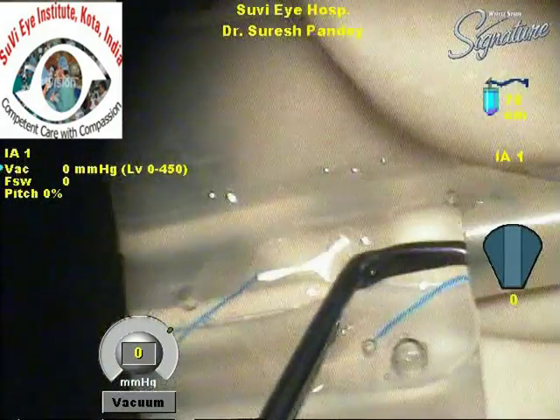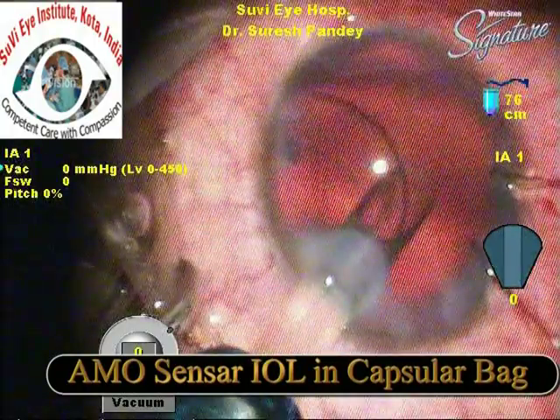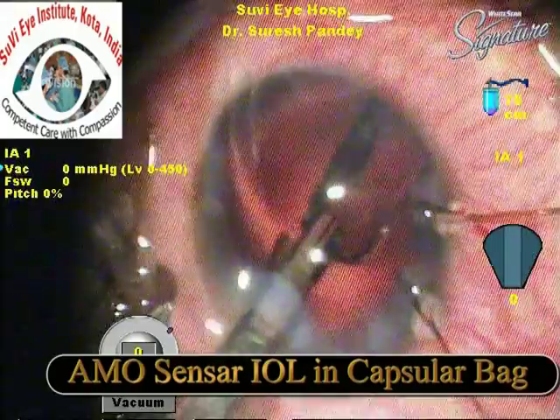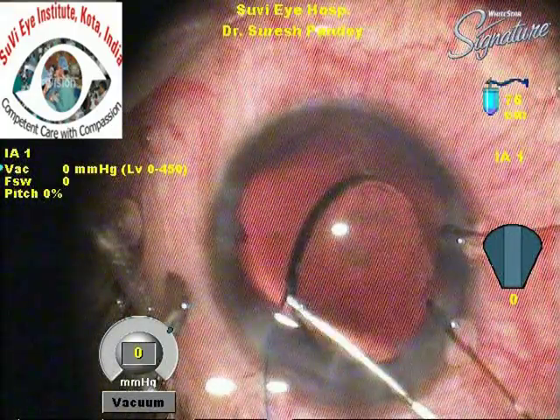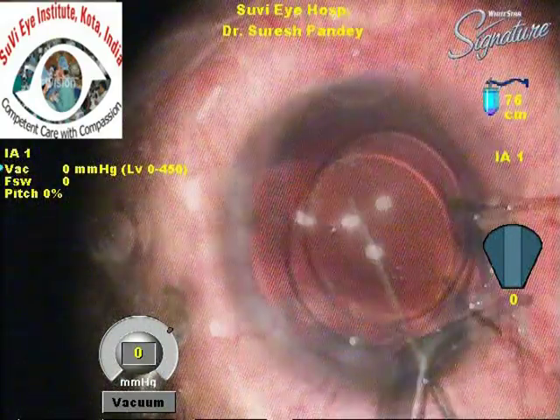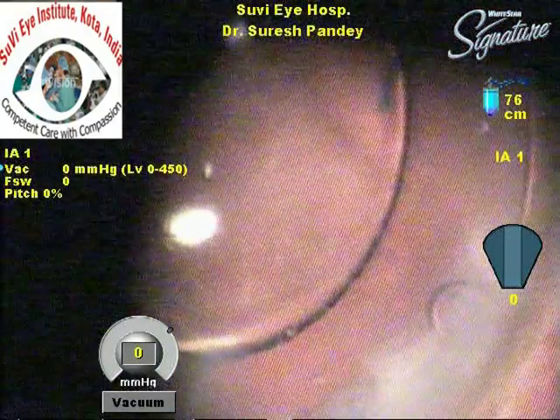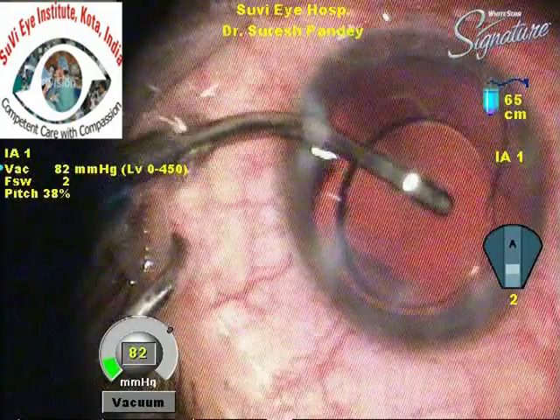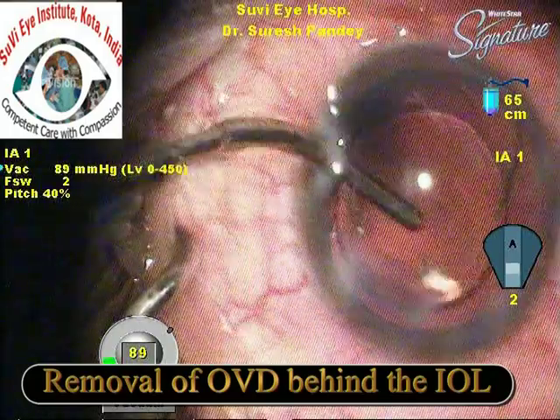Many surgeons prefer a single-piece IOL in these cases as it is smoother, but a three-piece IOL can also be implanted, ensuring it does not open suddenly in the capsular bag. An AMO Sensar IOL is implanted here and dialed into place with the haptic positioned in the direction of the capsular dehiscence to stabilize the capsular bag post-operatively. Viscoelastic is removed from the capsular bag, especially from under the IOL.